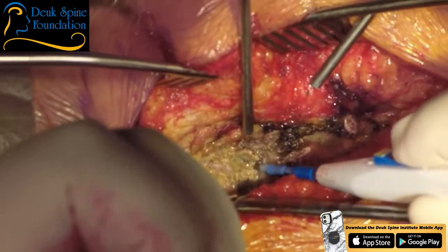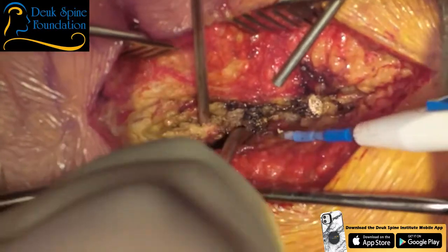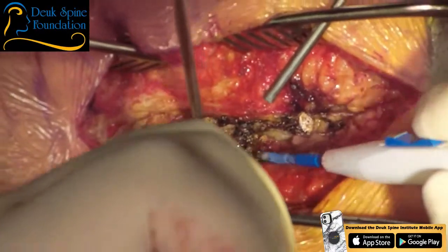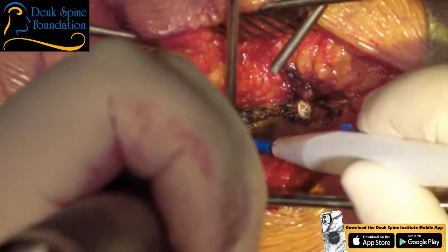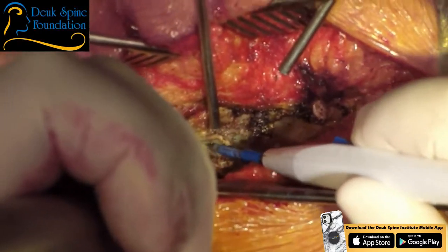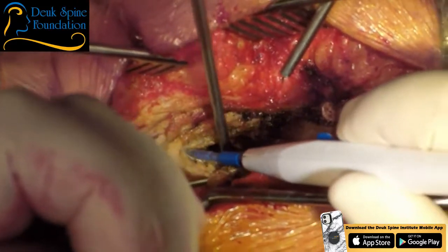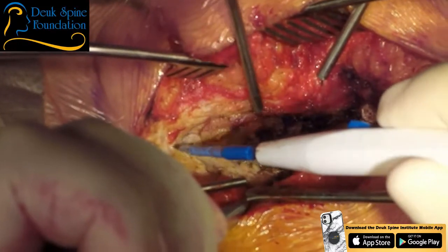This is going to be a deep one. Very deep. I can tell you that right now. We're already struggling with our visibility here, to being able to see. There's nothing else I can do to make it better. Basically, I can just open the incision wider.